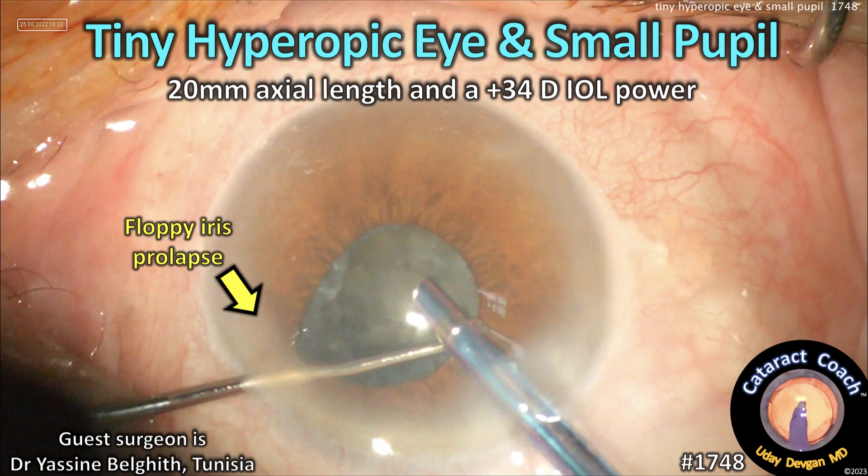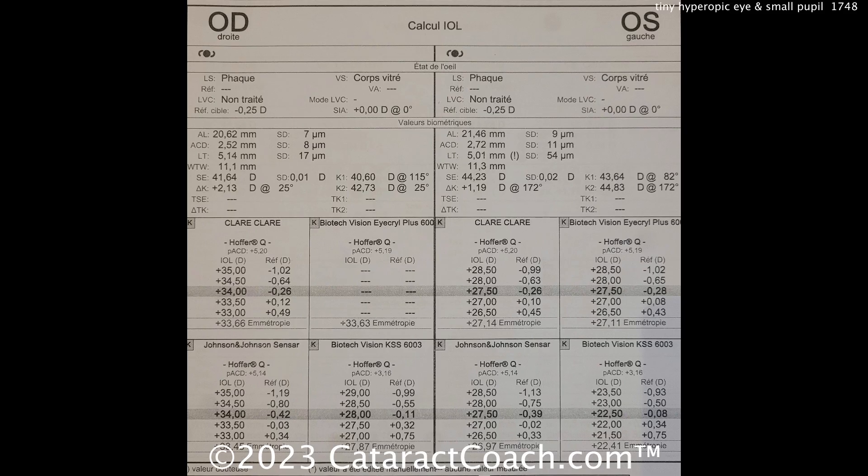CataractCoach.com — a tiny hyperopic eye with a small pupil, 20 millimeter axial length, a 34-diopter lens, and floppy iris prolapse.